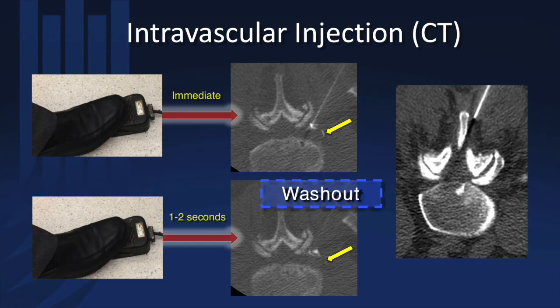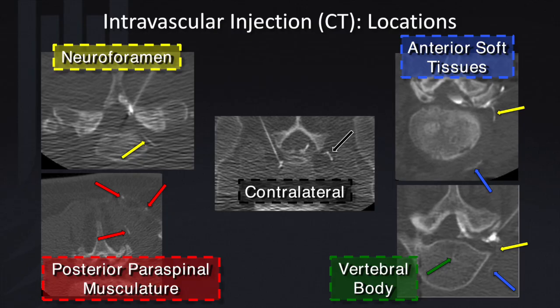And so I think I'm going to have a movie here that hopefully, let's try again. That's going to play, hopefully. Let's see. One more time. Nope. Okay. There was a movie that is not going to play. Sorry about that. But basically what you're looking for is washout of that contrast.